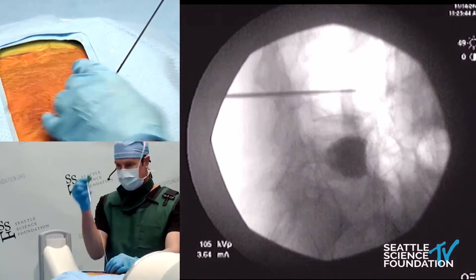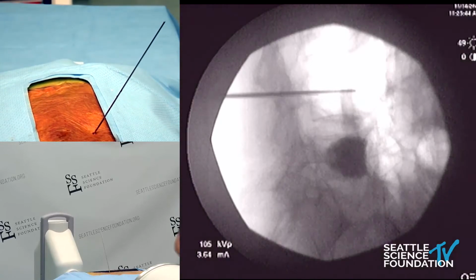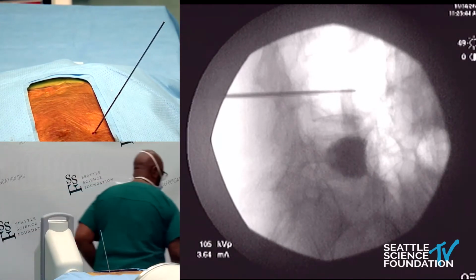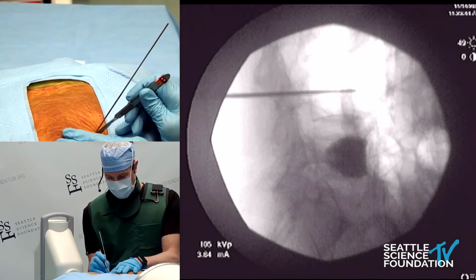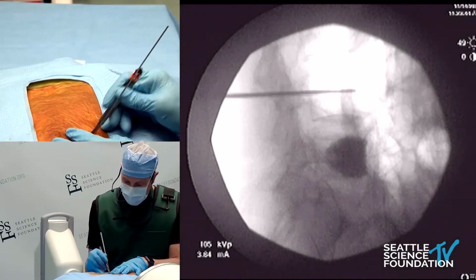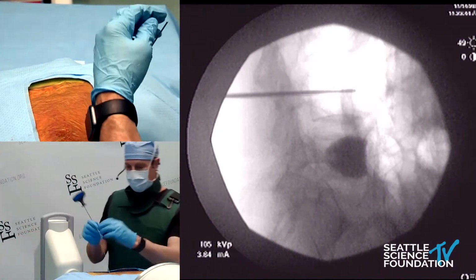I will need a knife. There's one over here. Yep, I got it. Perfect. So just make this a little bit bigger. The spine jack that we'll use here will be a 5.0, and it's about the size of a number 11 blade plunge incision.